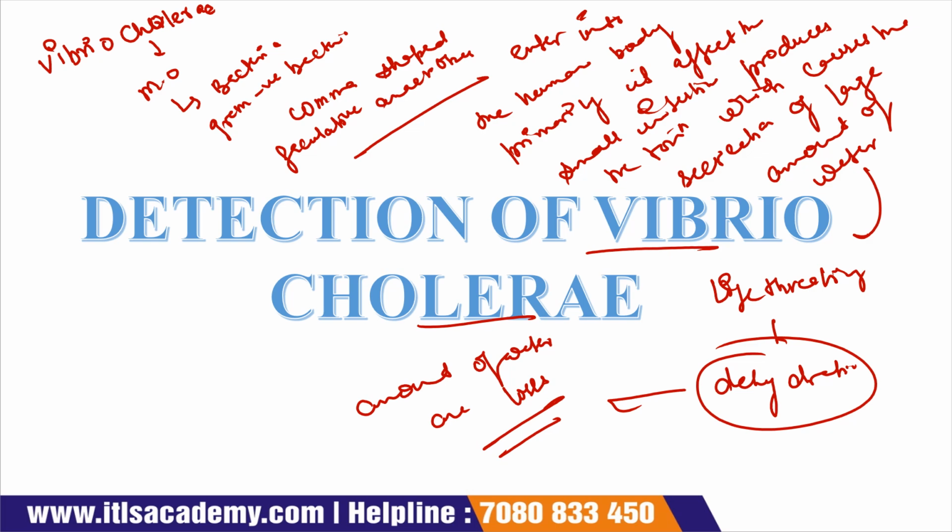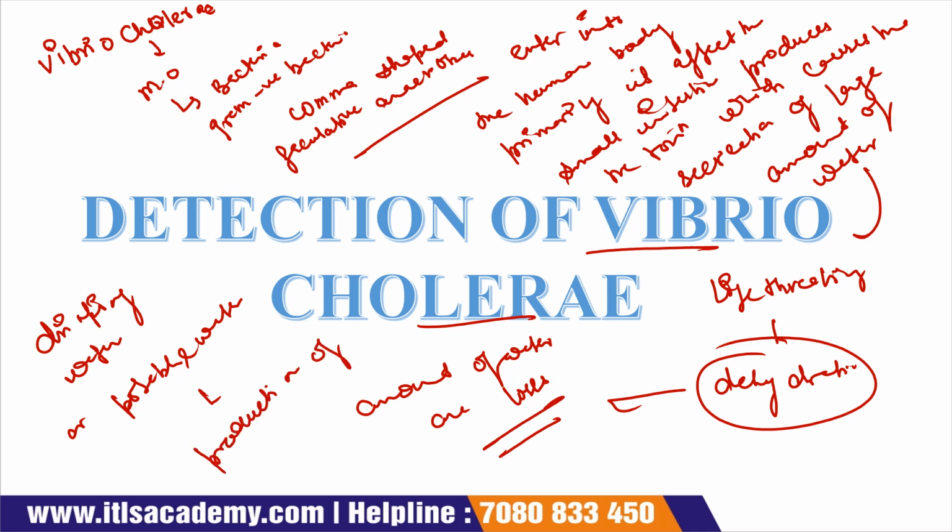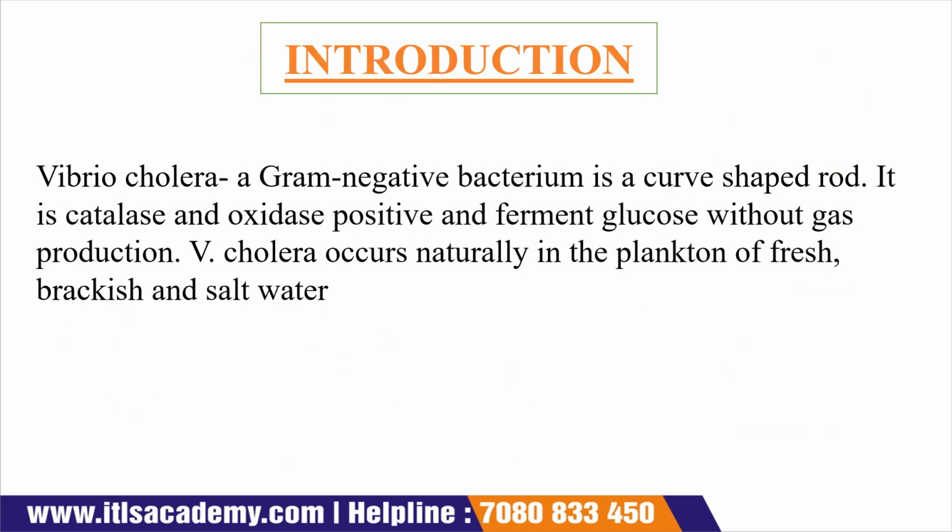So that's why it is very important to detect Vibrio cholerae in our water, especially our drinking water, or you can say potable water, because potable water is used in the production of food products. So it is very important to detect this microorganism, a gram negative bacteria, in the water. Now let's start the lecture.